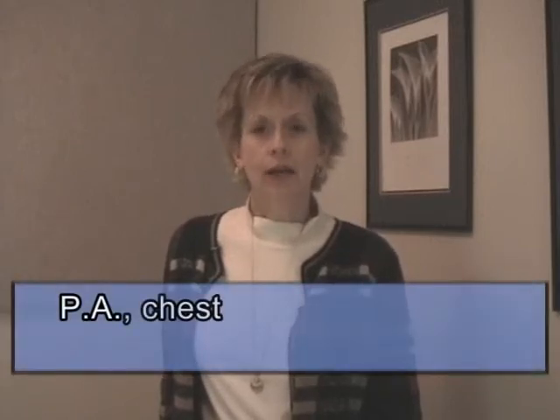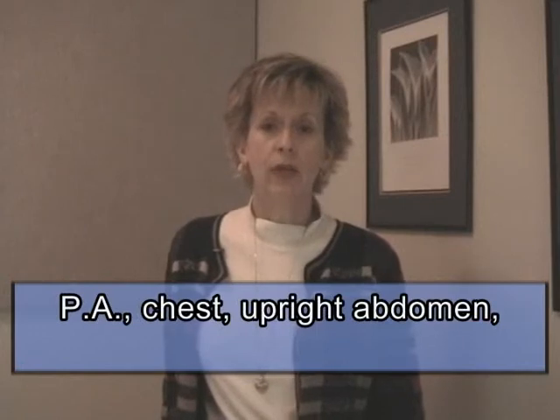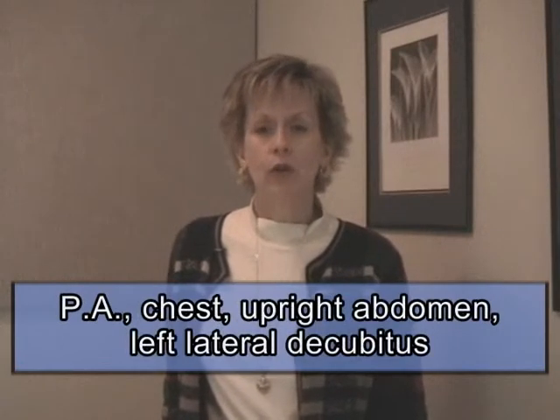The abdomen series that I'm going to discuss today consists of 4 projections: the PA chest, upright abdomen, a supine KUB, and a left lateral decubitus. The abdominal series protocol may change from institution to institution, but if you know those 4 projections, no matter where you go, you should be able to complete an abdomen series.